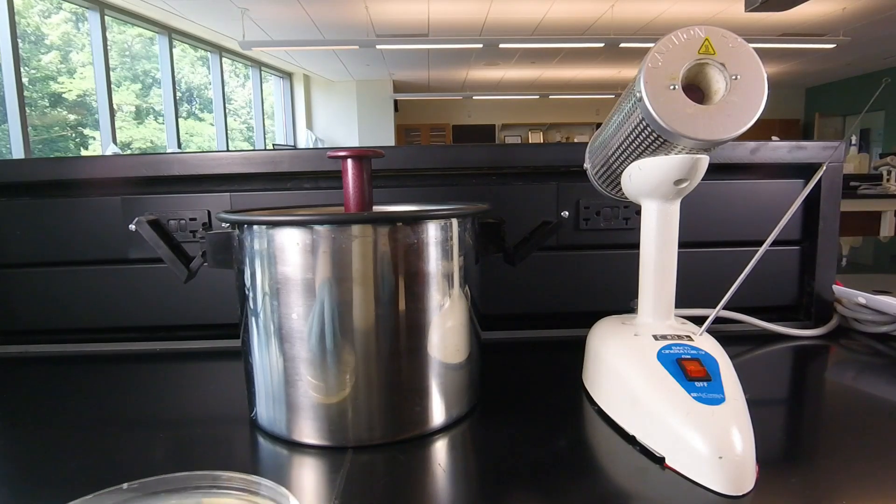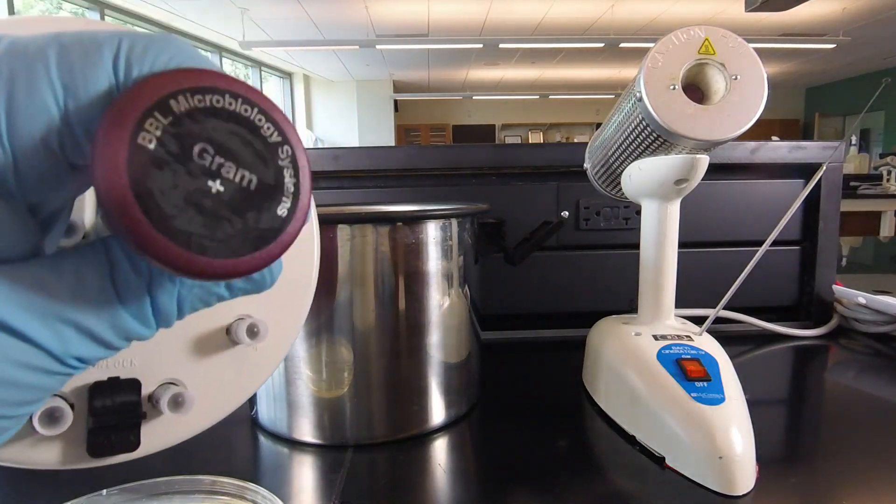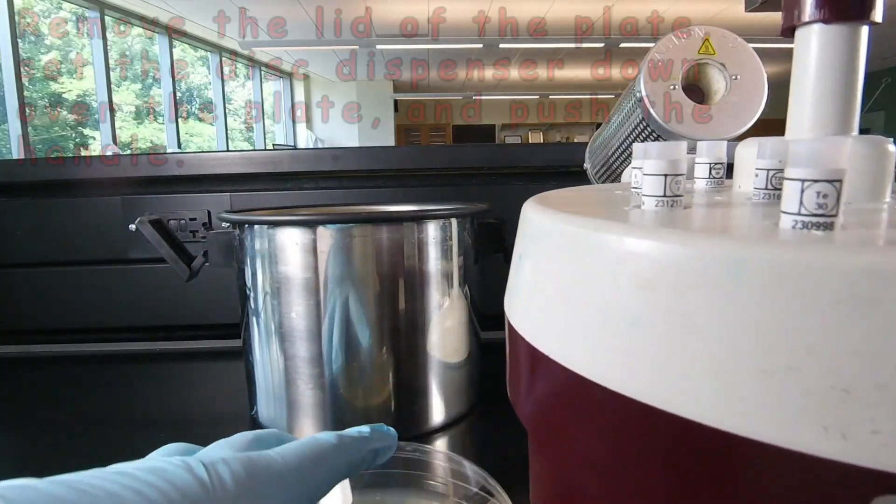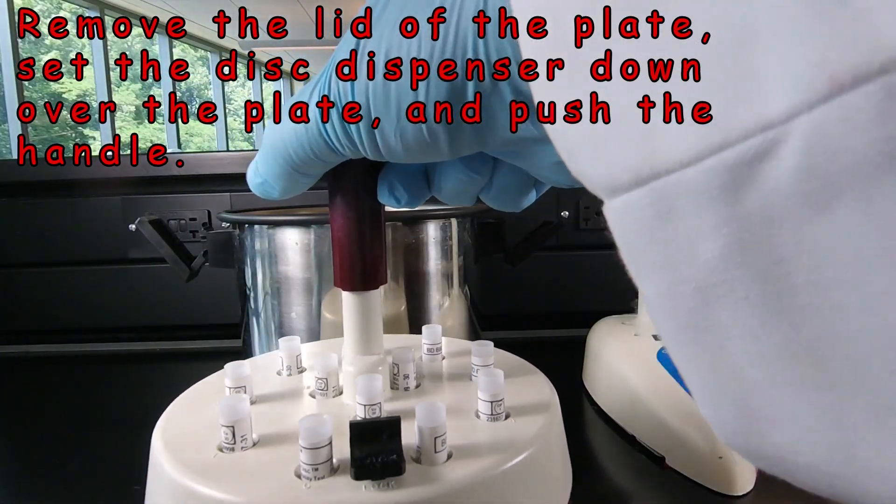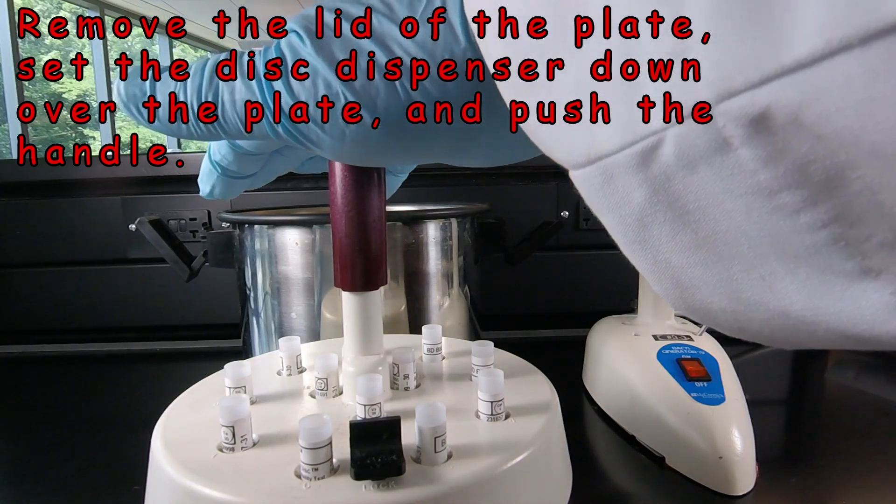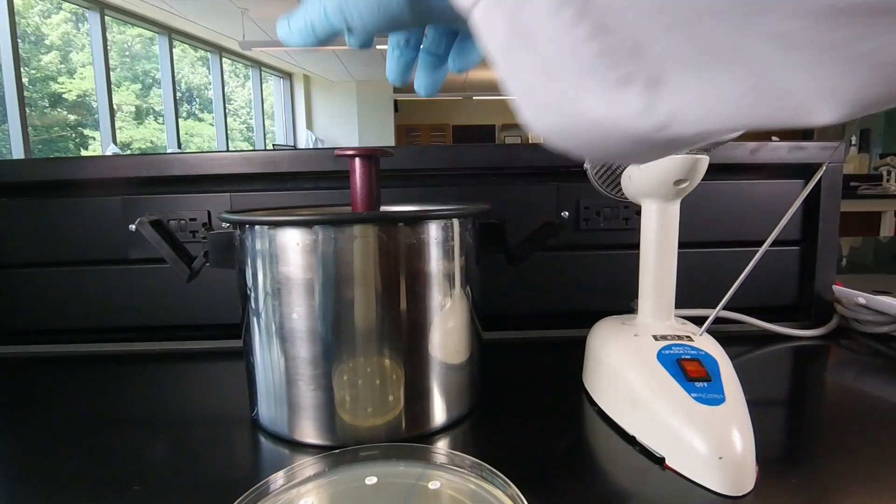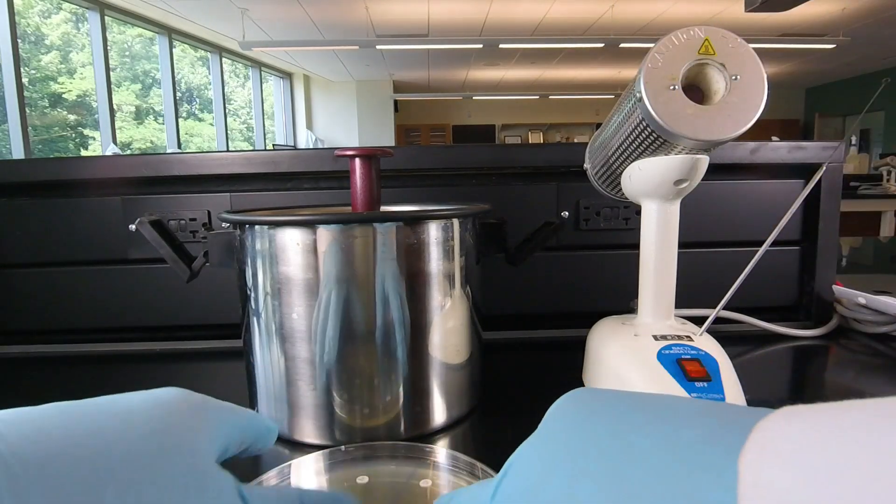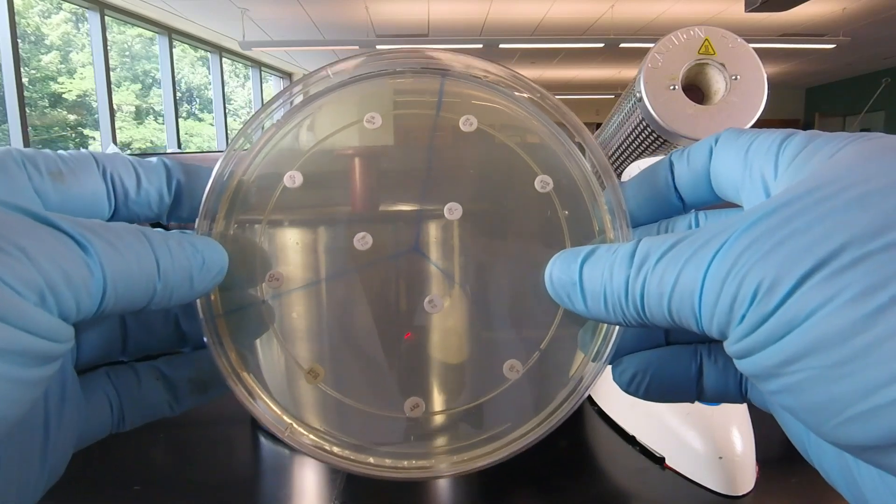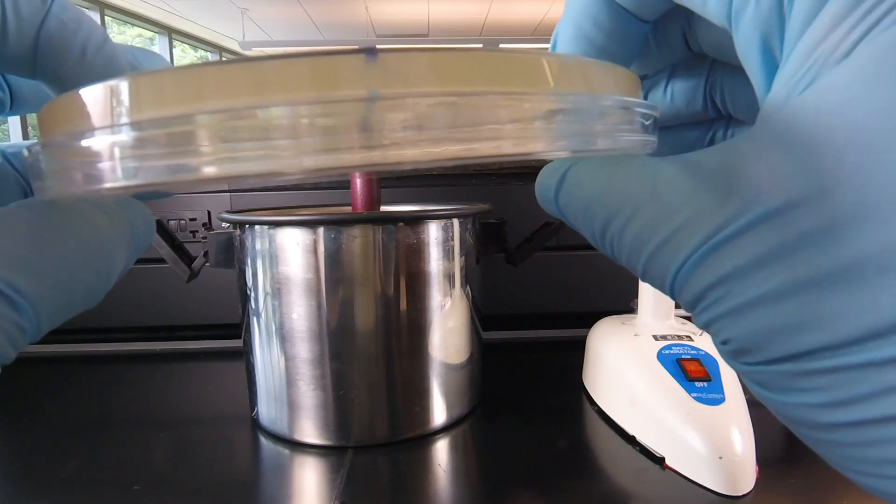Very simple to put on the antibiotic disc. We remove the disc dispenser. It also says gram-positive on the handle. And we're going to take the lid off of the plate. Put the antibiotic disc dispenser down over the plate and push down firmly on the handle. And as you see, that dispenses the 12 antibiotic discs. And it also tamps them so they won't fall off when we turn the plate upside down and incubate at 37 degrees Celsius.